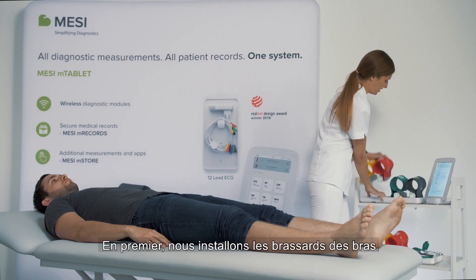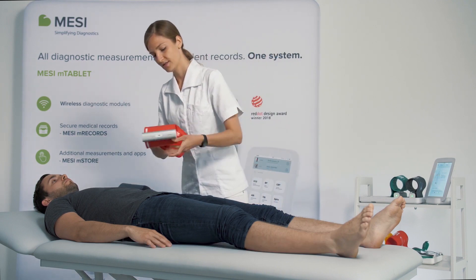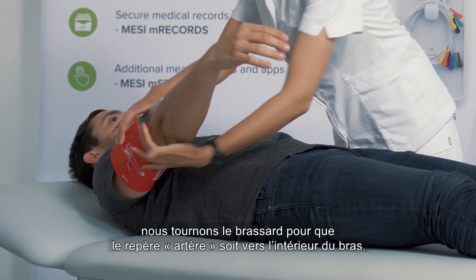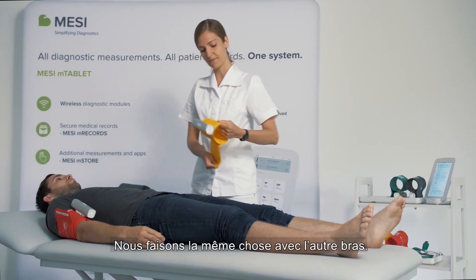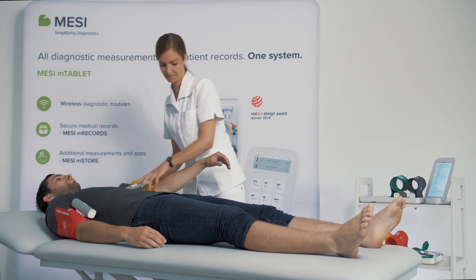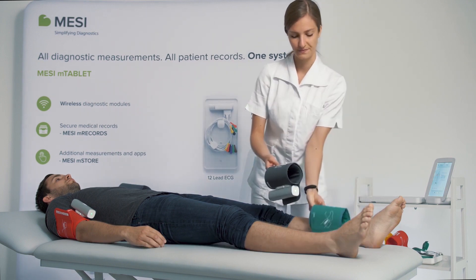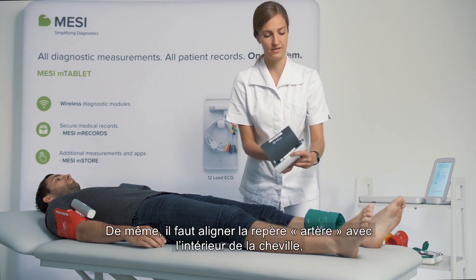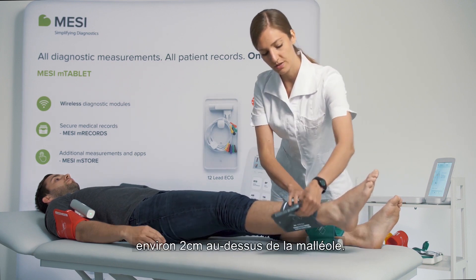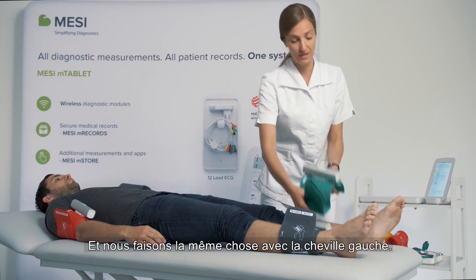First, we'll place the arm cuffs. Based on the printed guidelines, we turn the cuff so the artery mark is pointing towards the inner arm, and we do the same on the other arm. Next, we place the ankle cuffs, making sure the medial ankle mark is pointed inwards, about two centimeters above the ankle, and we do the same on the left leg.